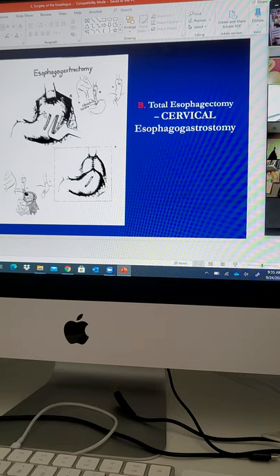So this is called TA. If I use a TA 90, then I don't need a TA 50, right? And stapling instruments are GIA, TA 90, 55, and a 30. That's a different size, okay? Different length. We'll go over that. I'll make sure I tell Miss Martin, when you go in the lab, you look at those.